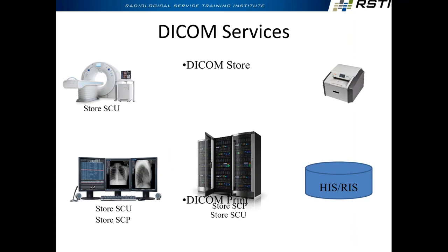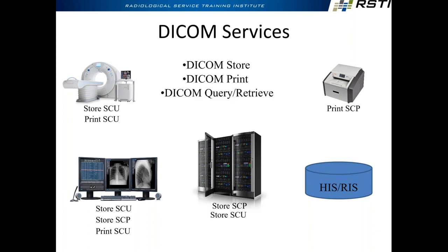DICOM print, pretty self-explanatory. The printer is the provider. Any device that wants the print is the user, the SCU. Query retrieve, you've already gone through this. The PACS is providing the query retrieve. And a lot of modalities will support query retrieve. CT is one of them that often does. In this example, I made this one, but it's arbitrary. It could be whatever.